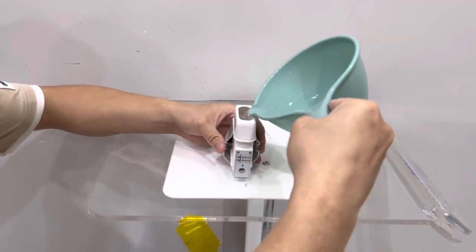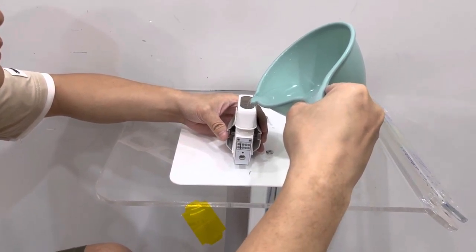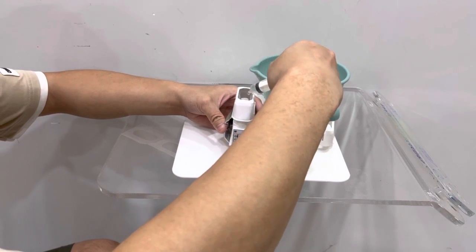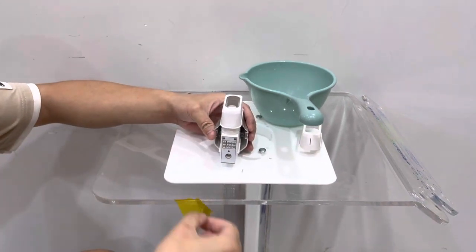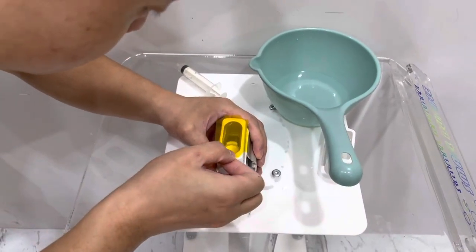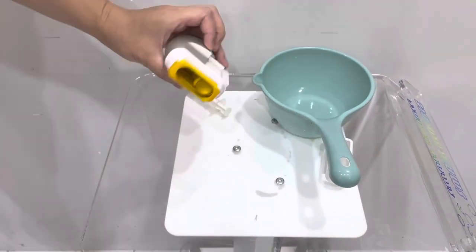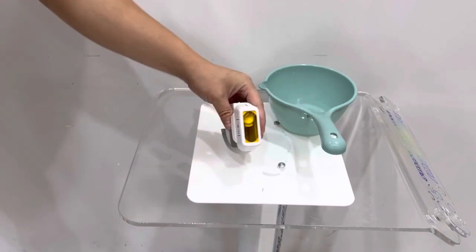Start adding water into the cartridge. Make it full enough but don't let it leak out. Then put the stickers on it. Finally, connect the white plastic part again.